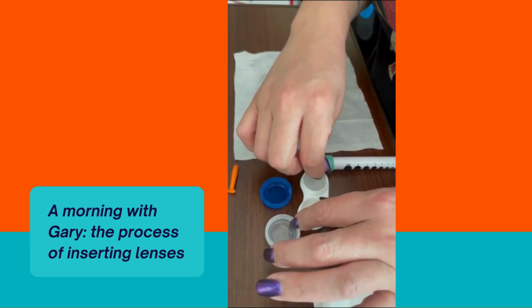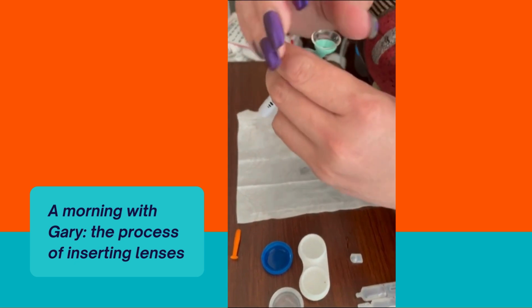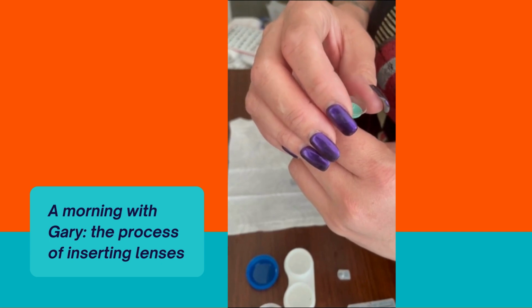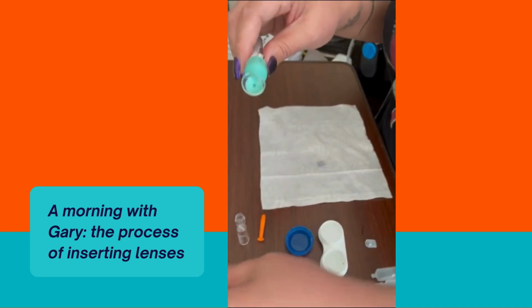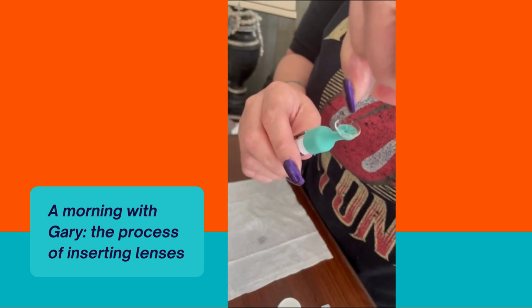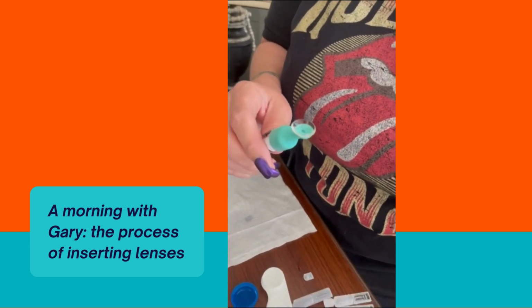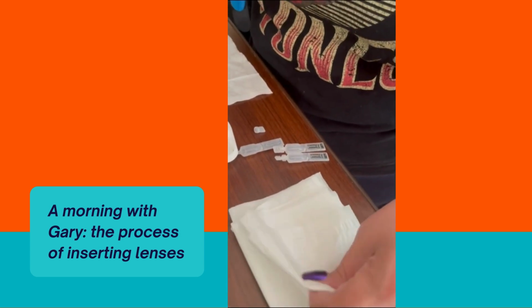So I'm just going to rinse it because I did do a lot of touching. I'm just going to rinse it one more time. And I'm right-handed, so I'm going to put it so that the dot is going to be at the top. So I flop it directly into the right eye. And we hold our tool sideways like this. Right eye being at the top. Okay, awesome. We put in 4 drops. 1, 2, 3, 4. Okay, so got 4. Once I've cleaned, I use the Kleenex to keep my hands dry because it'll slip on Gary's skin. It kind of makes it harder to put the contacts in.